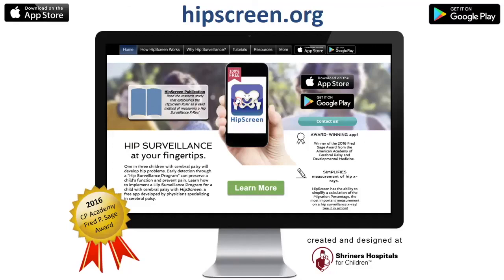I hope that this presentation has given you some flavor of the HipScreen app and its utility for community-based hip surveillance in children with CP. I really encourage you to go to the tutorial section of the website here. And on that tutorial section will be a copy of presentations similar to this one. There will be PDFs of useful resources, a quick guide to help you quickly understand how to use the HipScreen app, and then also X-rays that you can use to test your ability to make measurements.